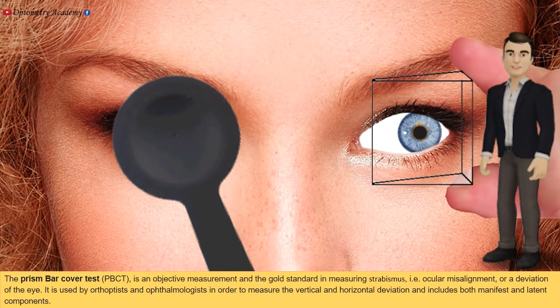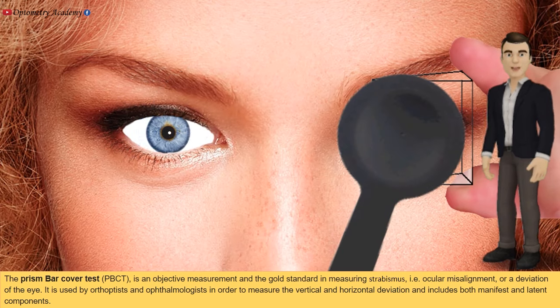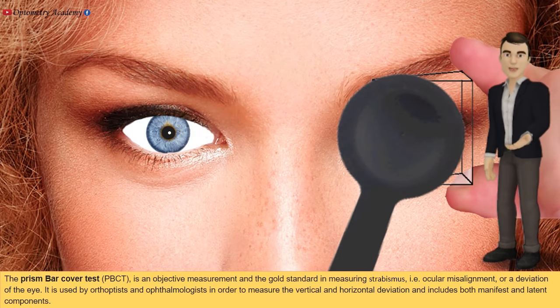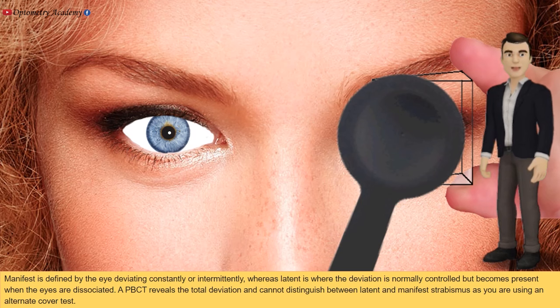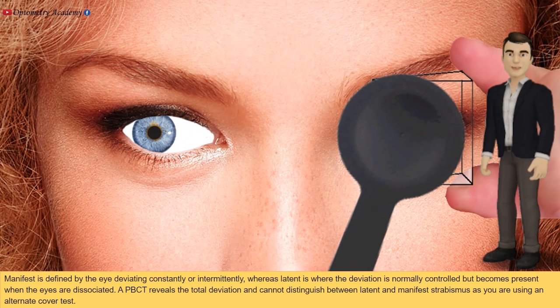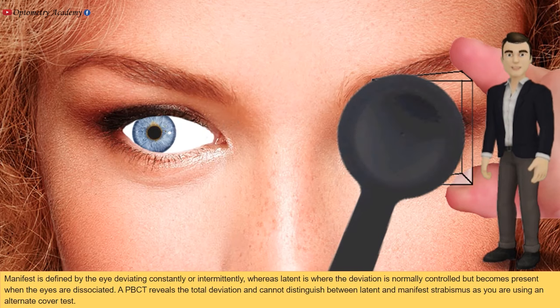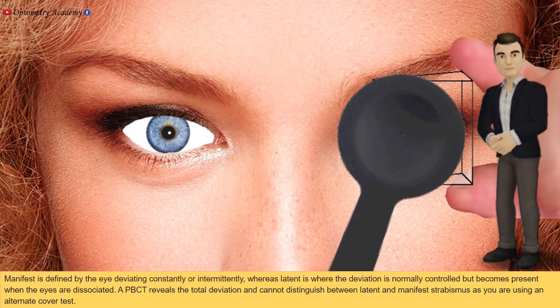The prism bar cover test (PBCT) is an objective measurement and the gold standard in measuring strabismus — that is, ocular misalignment or a deviation of the eye. It is used by optometrists, orthoptists, and ophthalmologists to measure vertical and horizontal deviation, and includes both manifest and latent components. Manifest is defined by the eye deviating constantly or intermittently, whereas latent is where the deviation is normally controlled but becomes present when the eyes are dissociated. A PBCT reveals the total deviation and cannot distinguish between latent and manifest strabismus, as you are using an alternate cover test.